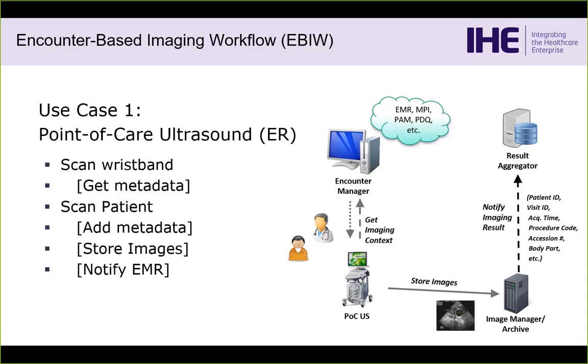We made sure that there was enough information in this notification that they could easily just do that. That would be an automatic process. They don't have to, according to the profile. If they just want to go ahead and index the study based on these, that's fine. But if they want to create that proxy order, they can do it.